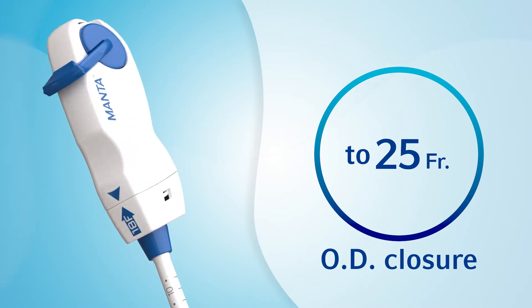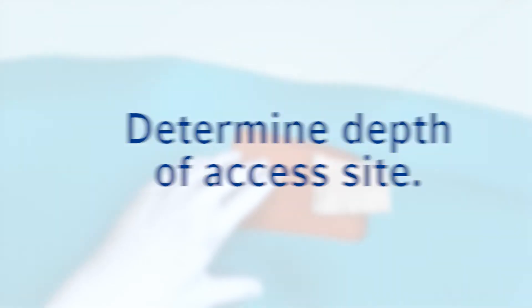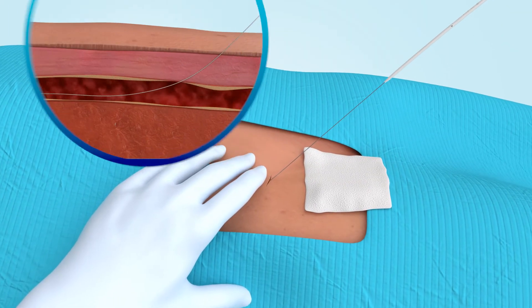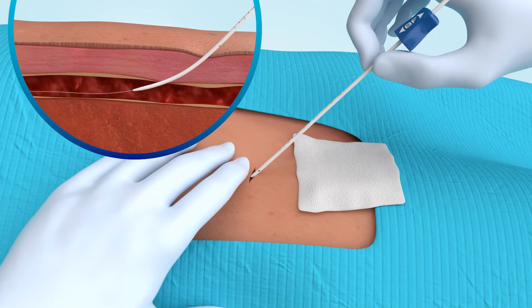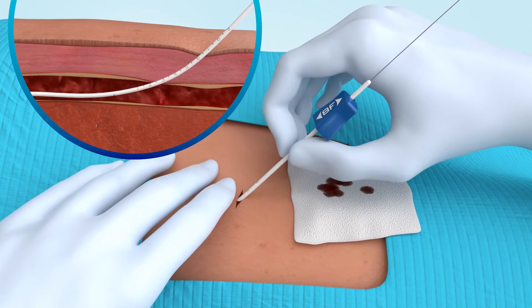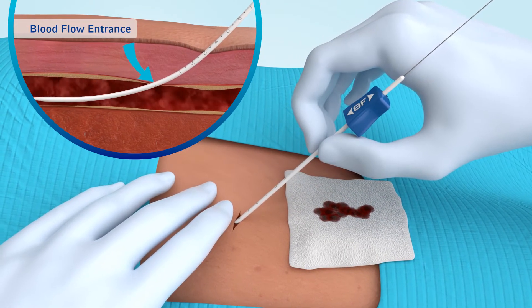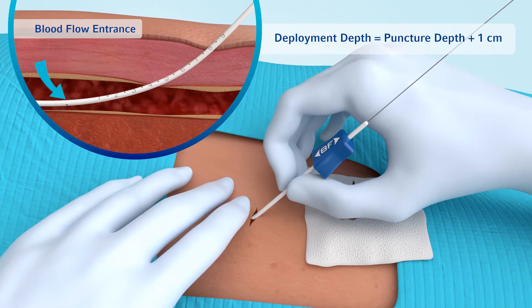Before the large-bore procedure, determine the depth of the access site using the depth locator. This is fully inserted over the 035-inch guide wire until blood flow is detected at the outlet. Retract the depth locator until flow stops and note the position number at skin level, indicating the access site depth.